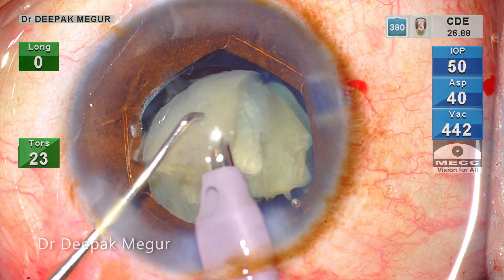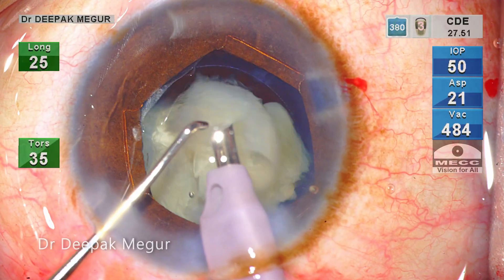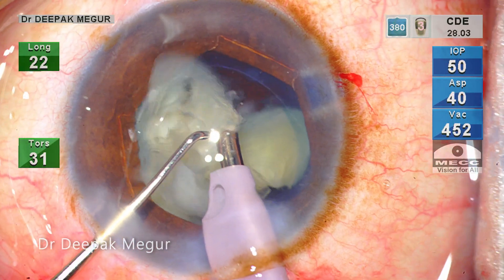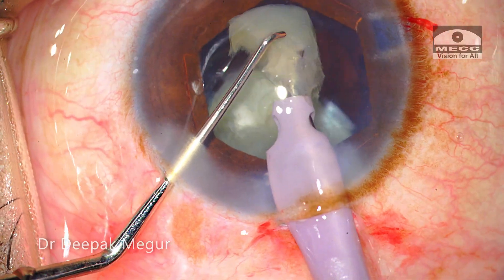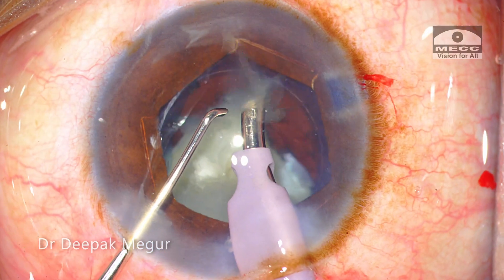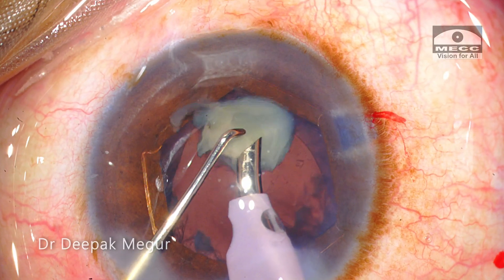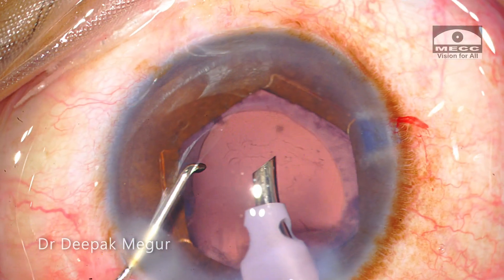As is evident during the process of emulsification, we can see that the plane of emulsification is much more anterior than what I would usually recommend and practice. This is primarily because of the situation we are in — the presence of a discontinuous rhexis. It is much safer to emulsify the fragments as far away from the bag as possible in this scenario.